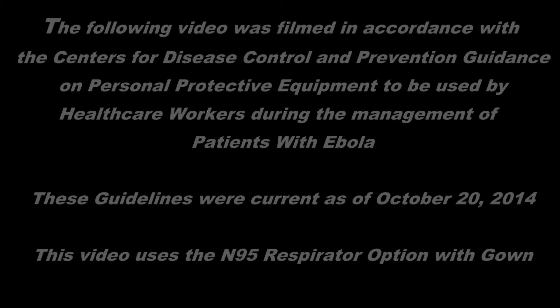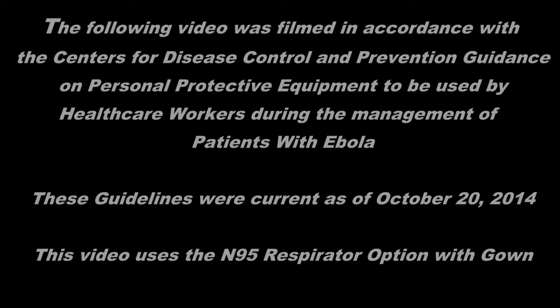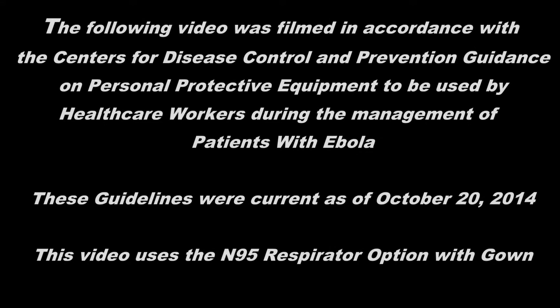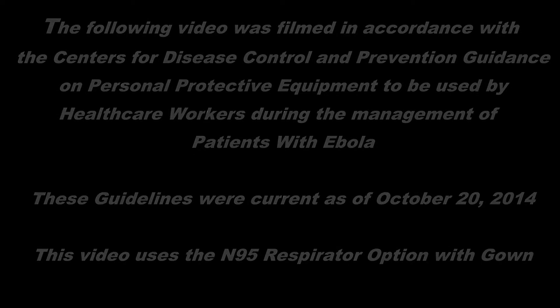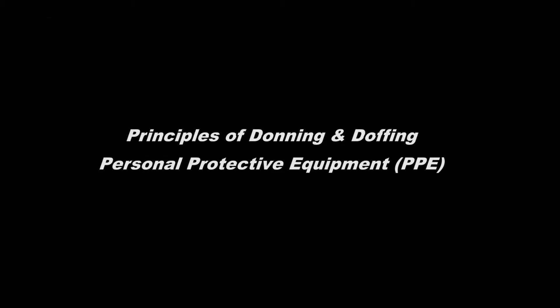The following video was filmed in accordance with the Centers for Disease Control and Prevention guidance on personal protective equipment to be used by healthcare workers during the management of patients with Ebola. These guidelines were current as of October 20, 2014. This video uses the N95 respirator option with a fluid-resistant gown, and will cover the principles of donning and doffing personal protective equipment.